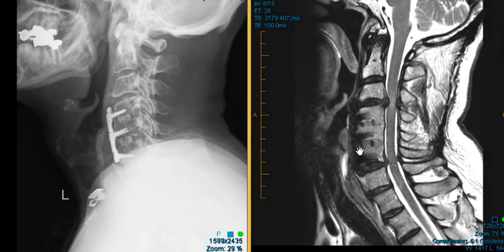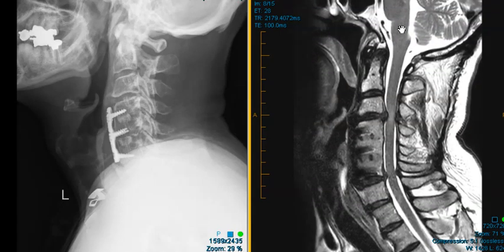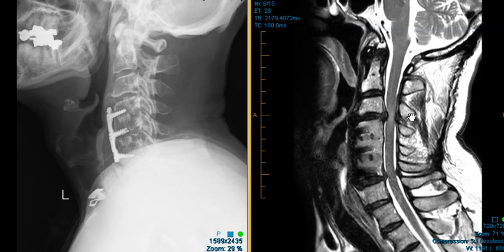This is a good example of what happens whenever you have a block like this. The discs have been removed — it's just one big long bone — and it puts abnormal stress on the disc level above and below the fusion. Not uncommonly, as in this case, we see a disc herniation between C3 and C4. You can see the disc herniating backwards and the spinal cord getting flattened and compressed right at this level.